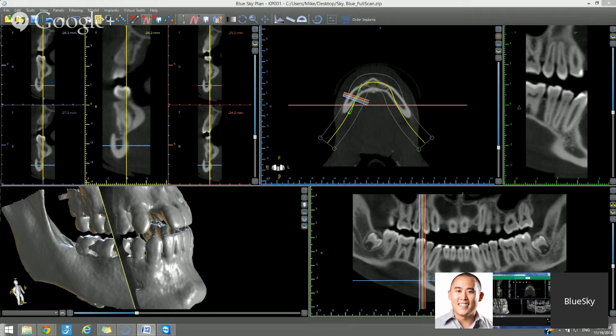Generally, an hour is a good amount of time to get somebody from a starting point to the point where they're using the software pretty comfortably and can place implants and do the things that we're going to be discussing today. The webinar is going to be recorded as well, so it's going to be live on YouTube once the training session is over.